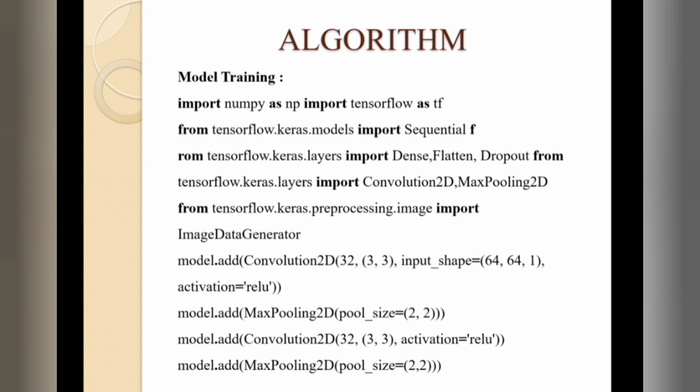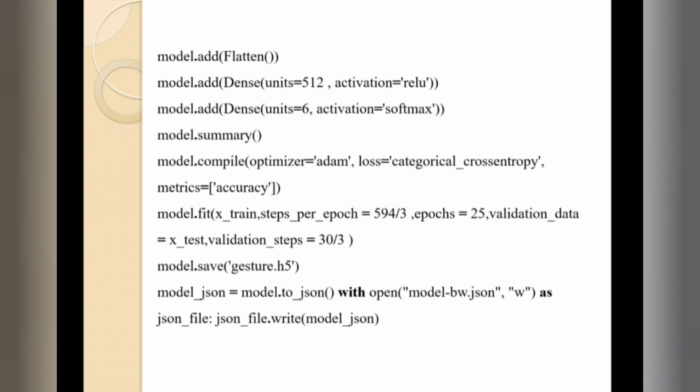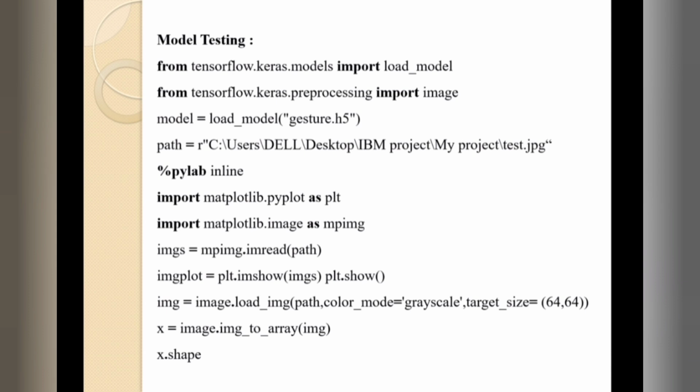These are the algorithms we are using in this project to train the model. And these are the algorithms we are using in this project to test the model.